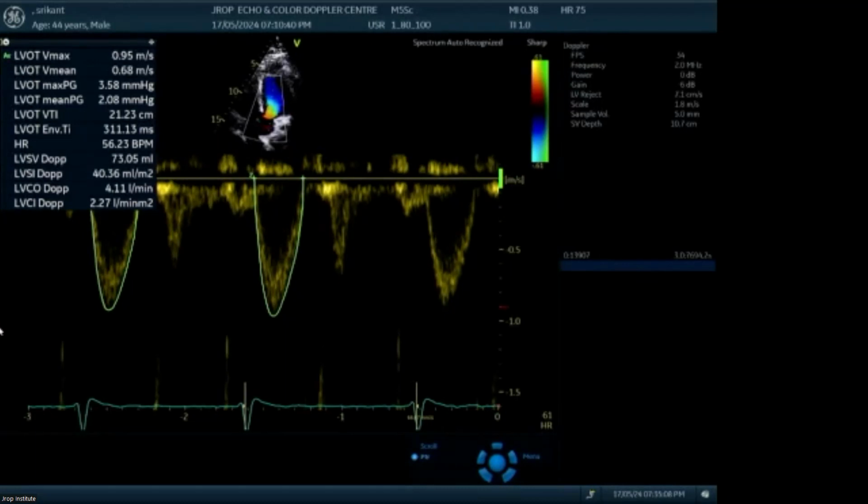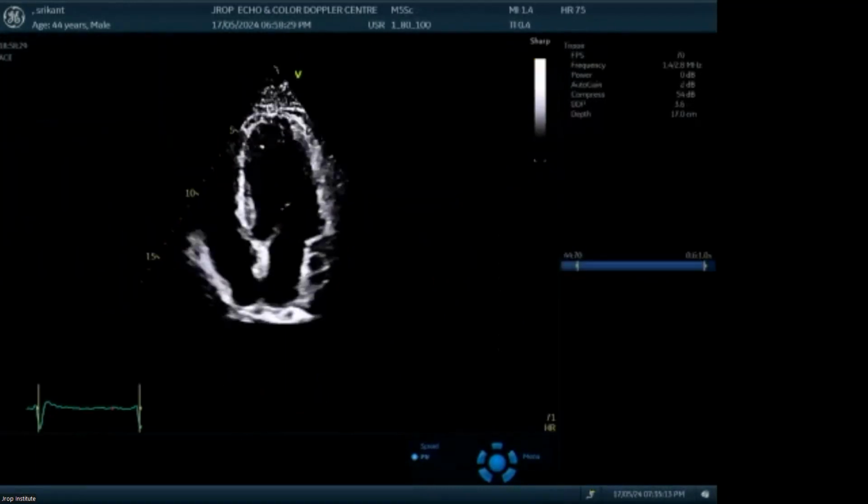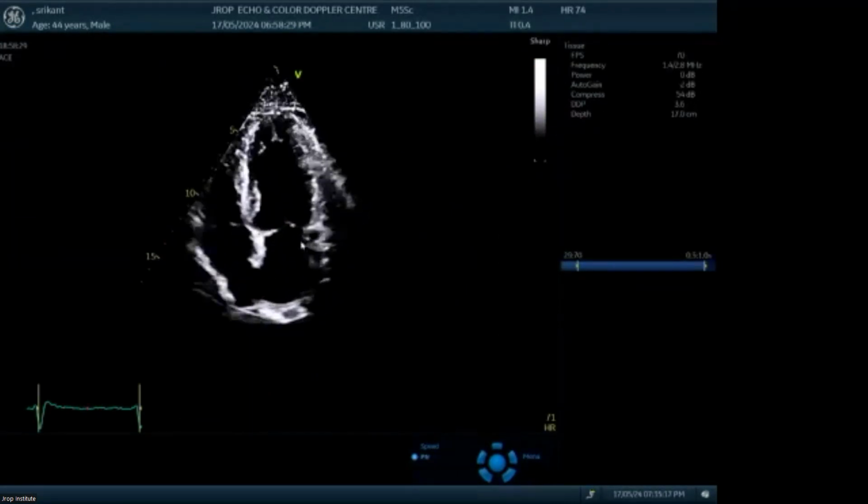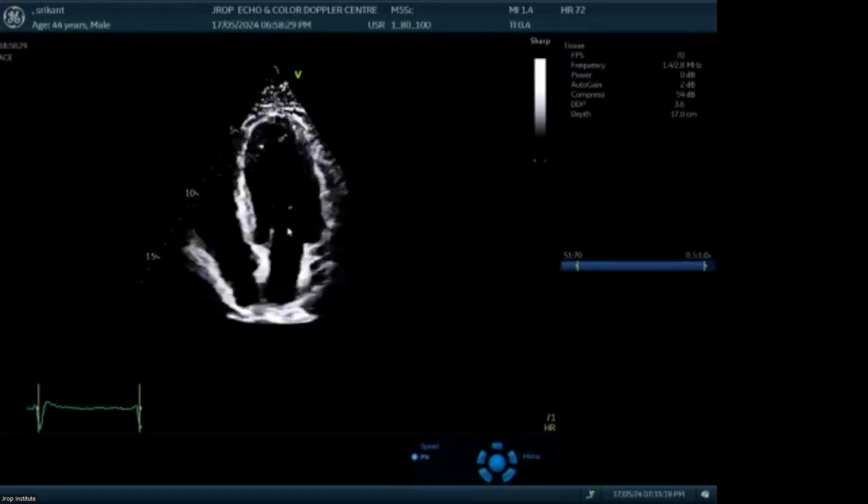Okay. What you're talking about, I'm talking about this annulus diameter. What you're talking about is the stenotic diameter. This stenotic would be here, at the tip of the leaflets. So when we calculate by planimetry, it is for mitral stenosis, and we'll be calculating at the tip of the mitral valve leaflets, not at the annulus. So that will be used for grading of mitral stenosis.